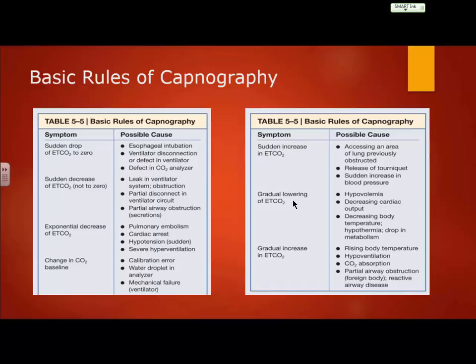We're artificially pumping the chest. We're artificially pumping the lungs. Best we're going to get is high teens, low to mid-20s. And that's okay. But then if I start seeing that CO2 start rising, I'm going to need to check my other parameters, because chances are this patient has started taking over his own pathways again. And now we've got return. Okay?